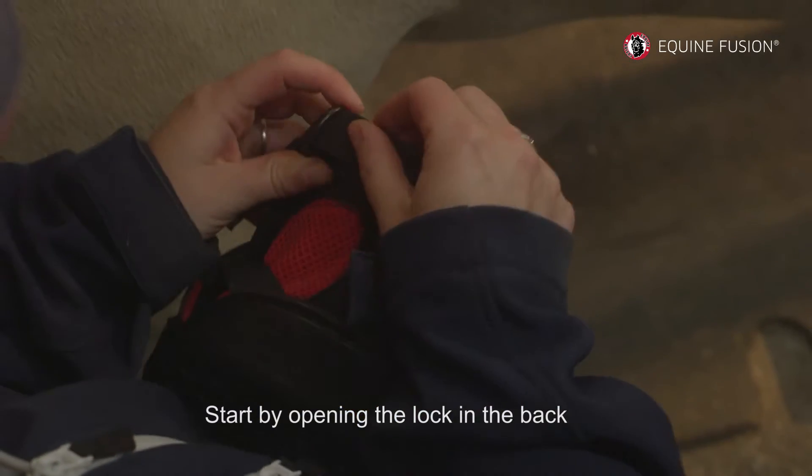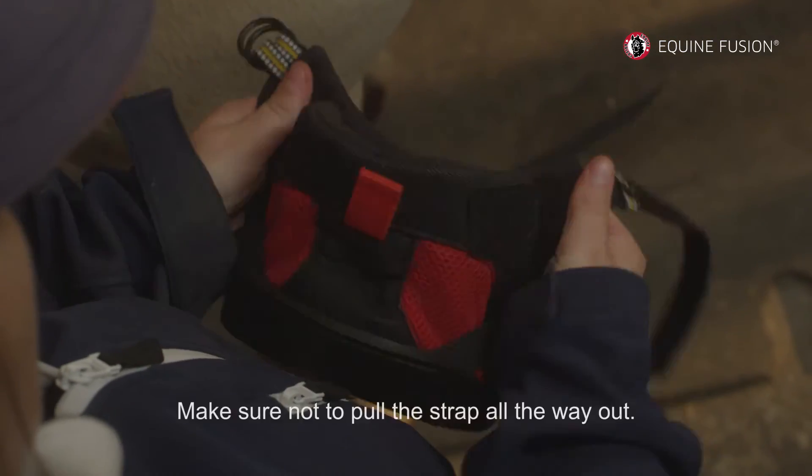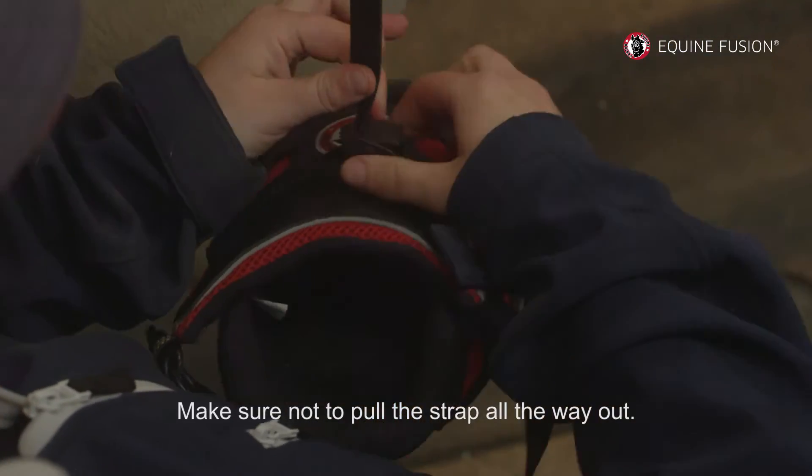Start by opening the lock in the back, then continue to open the lock in the front. Make sure not to pull the strap all the way out.